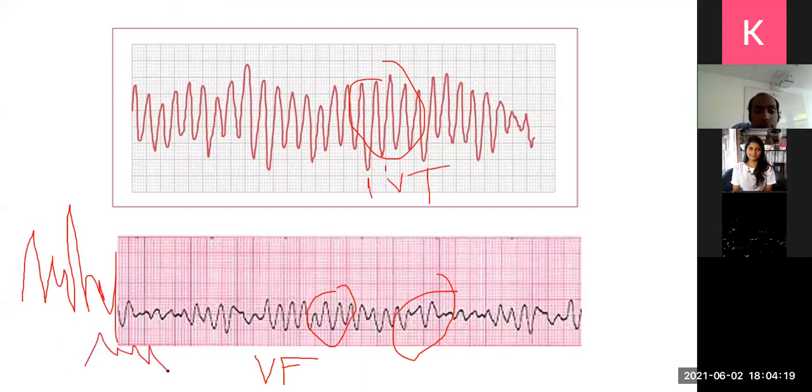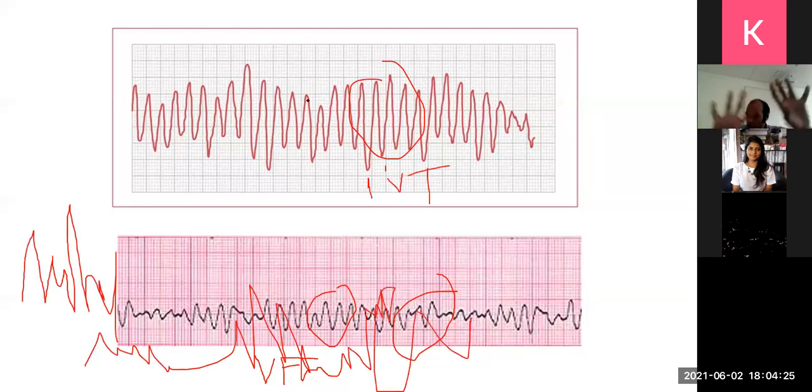There is no relationship at all. It's very chaotic. Polymorphic VT still looks nice. Same shapes but some are tall, some are short. Here it is completely abnormal. There are places coming here and there. Okay, that is the difference.